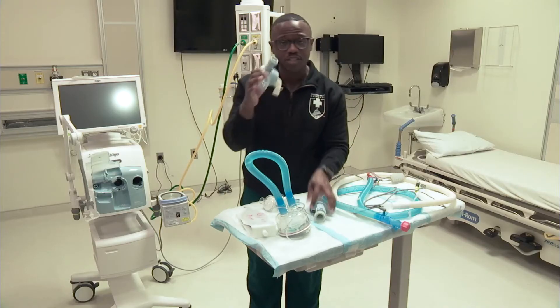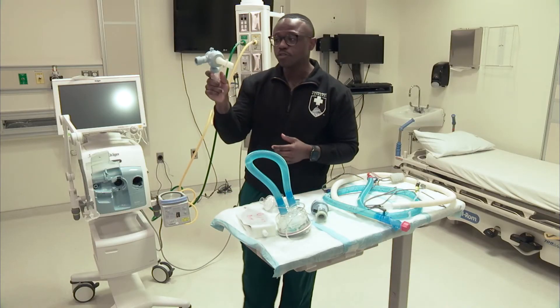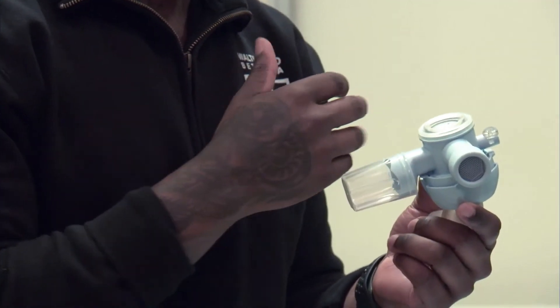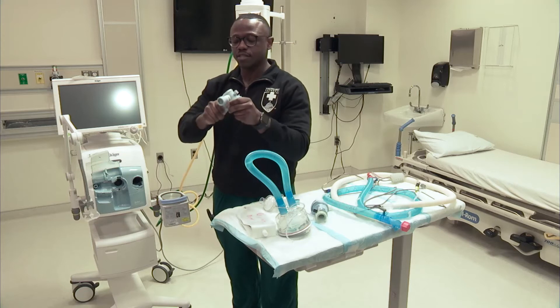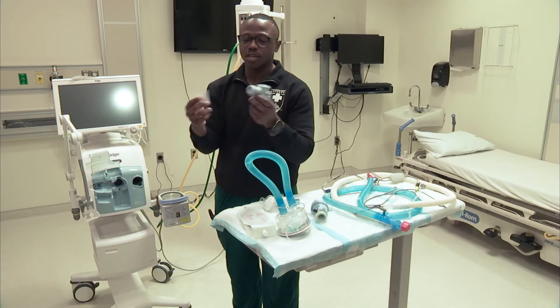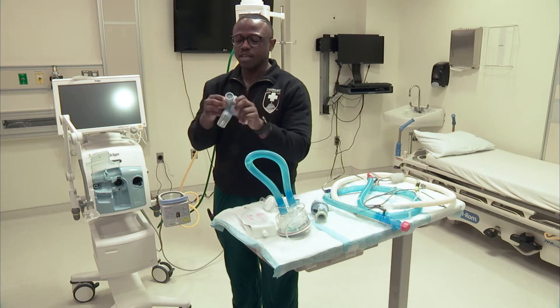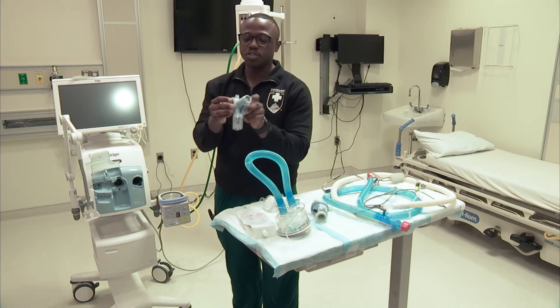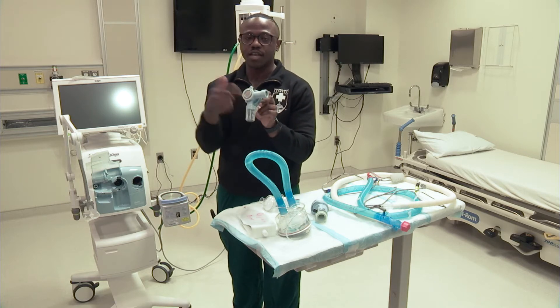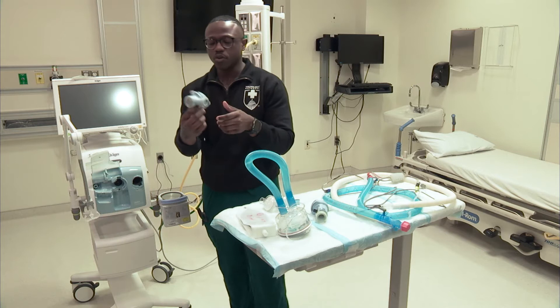I'm just going to start off with these valves. This first valve is the exhalation valve. This is single patient use, so after you're finished with this, we're going to dispose of it. It has this cup — like a water trap — where any condensation or rain-out can collect. It also has an external diaphragm. You want to make sure you have a tight seal on this diaphragm when you're inserting it, because that can give you some leak troubles on your circuit.